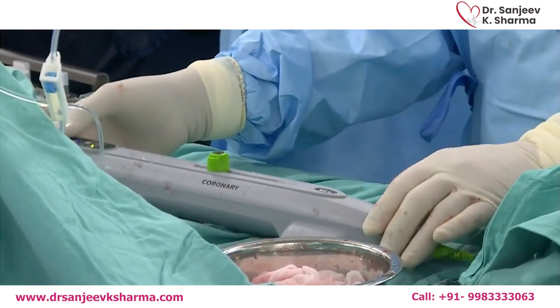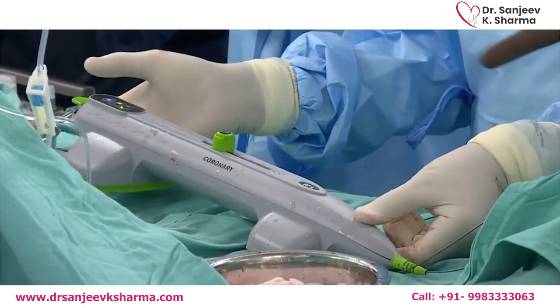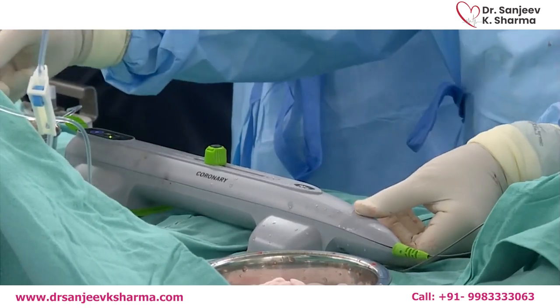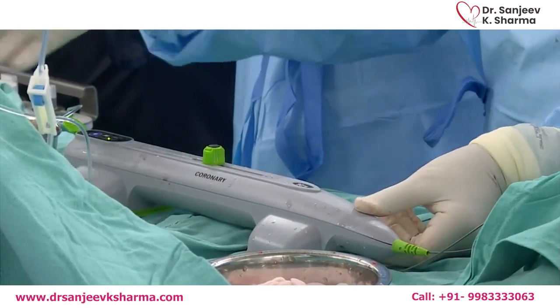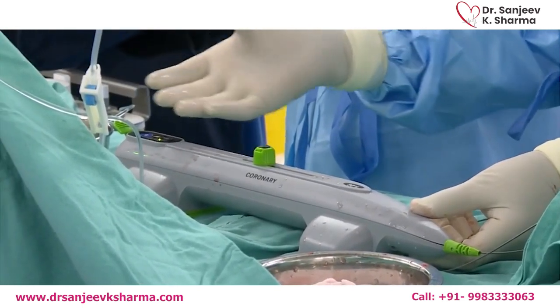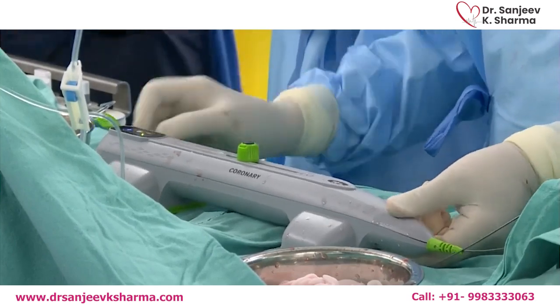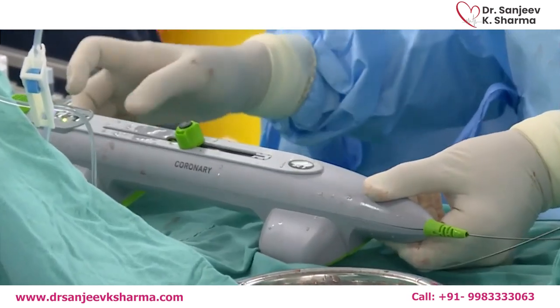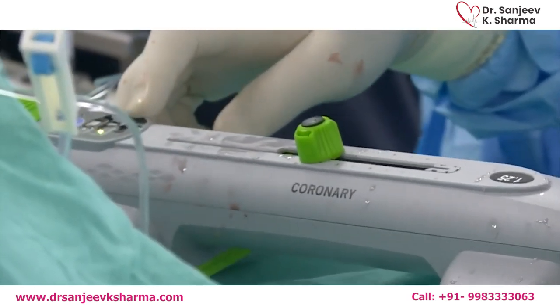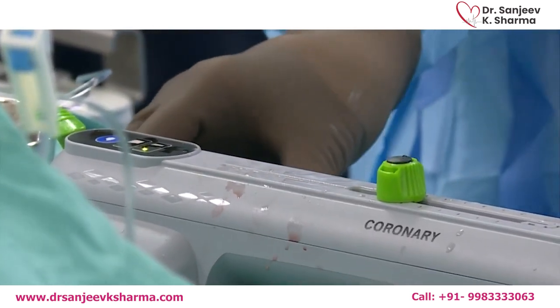So basically, once you stop it, this is the brake. Very good. And the fluid connection is about the same, with the speed of the fluid infusion. They say it's slightly faster in the orbital compared to the rotational. And these are the two buttons, which I would say are 80,000 and 120,000 RPM. So with that note, we are ready. We'll show you the IVUS pullback first.